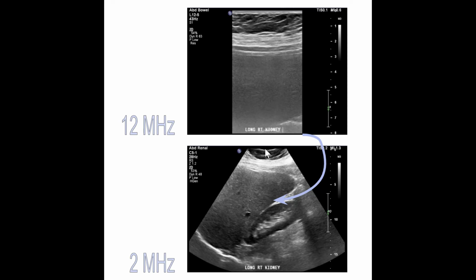We can then think about these interfaces that the sound beam is interacting with. First, we've got some scattering and some reflectors because we've got parenchyma and some really bright reflectors. When we get to the liver capsule, we're getting a very high reflection. We're getting that specular reflector. Looking at the tissue of the liver, we're getting that scattering. That's why we can see the solid organ. When we look through blood vessels, we get very little interaction, and so that's why they're anechoic. They're not really returning any echoes back to the transducer.